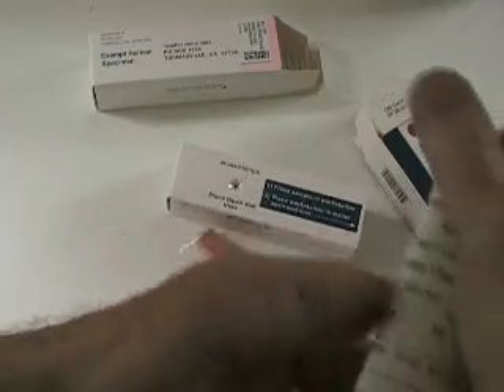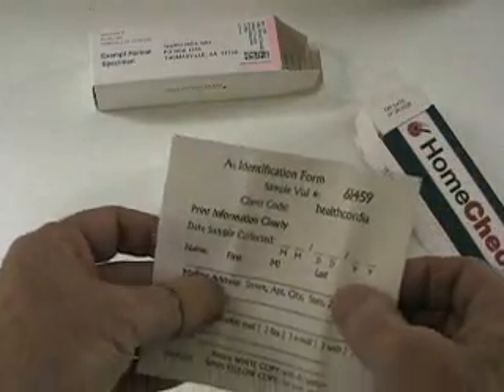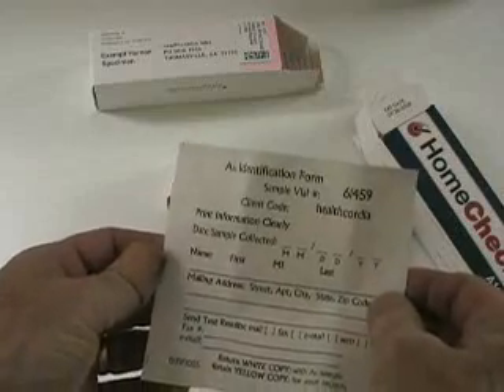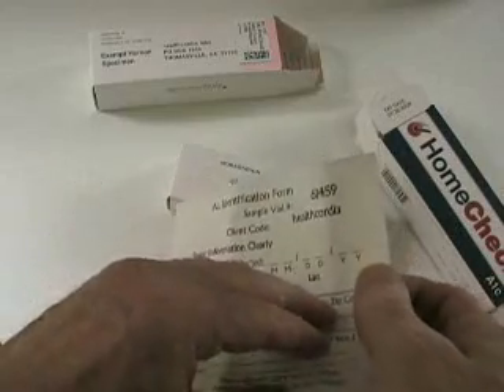It also comes with a form — a two-part form. You fill one part out with your name and address. Then you keep the yellow part, and you return the white part back to them.